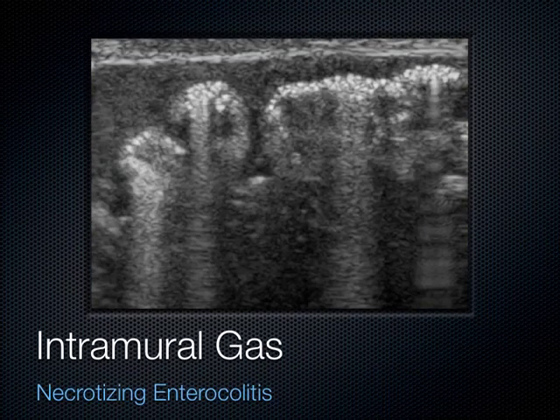And just another example of a patient with necrotizing enterocolitis. We can see all these punctate lesions here with some shadows. Now, people always ask me, does air cause dark shadows or bright shadows? It causes both. Sometimes it causes dark shadows, sometimes it causes bright shadows. There's a term for this that we use sometimes in medicine. It's called dirty shadows.